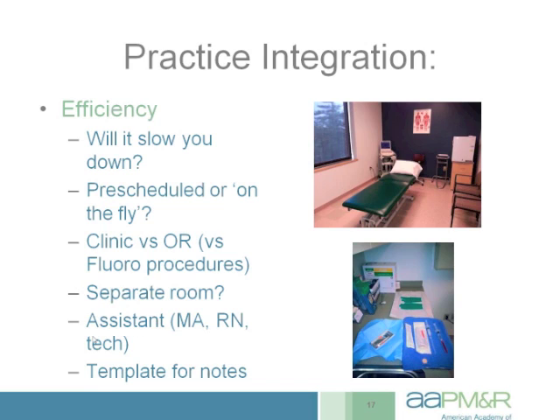One thing that's important to keep in mind with ultrasound procedures versus non-guided procedures you may be doing in the clinic is you're going to want an assistant. Someone's going to have to be handing you things so you can stay sterile. And someone's also going to have to be operating the machine. You may need someone to change the depth or capture an image. So in most cases, you're really going to want an assistant in the room, and that's something to factor in when you're planning for this.